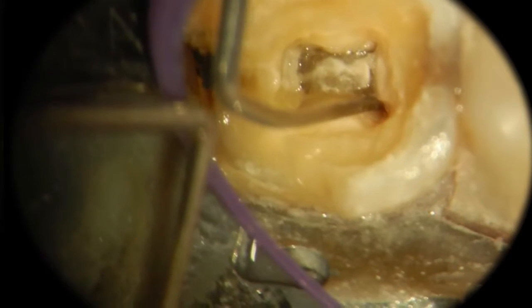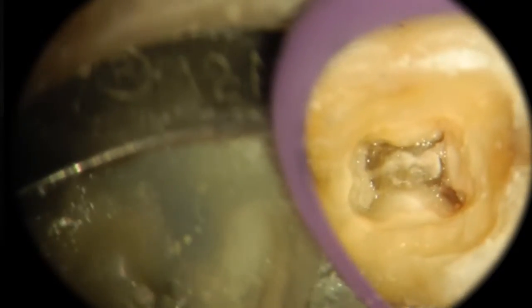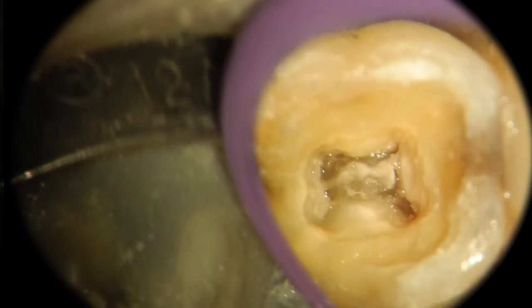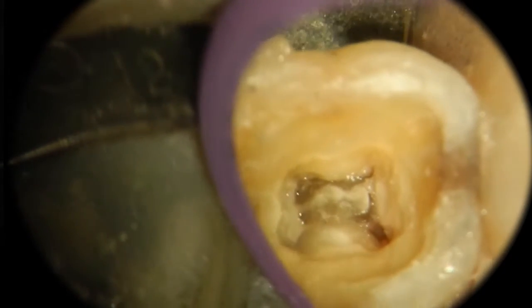And we know with a lot of confidence that there is going to be a canal right there. So a bleeding point helps orient you as to where the canal is exiting into the chamber. And now we're at 0.6, and again, the bleeding point is a trick in finding canal anatomy, but also a microscope.